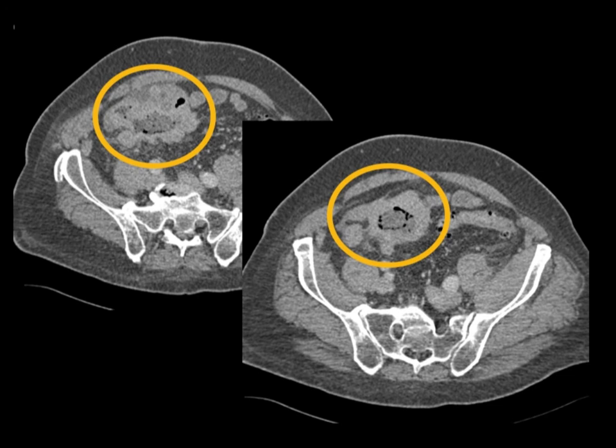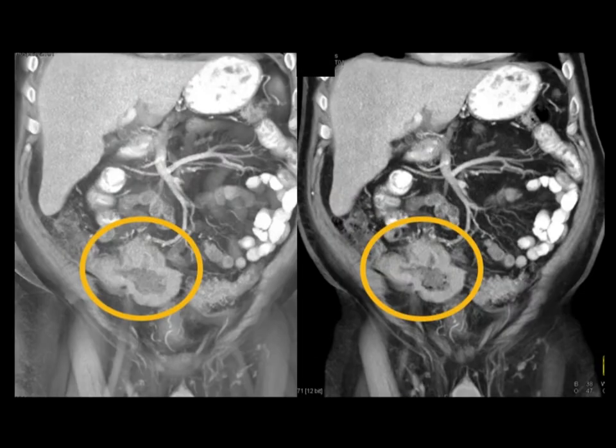And you're really sure it's lymphoma when you scan into the abdomen and you see this large exoenteric mass involving the terminal ileum. A very nice example of lymphoma of the small bowel. You can see here the ulceration on the coronal view. Again, it could be an adenocarcinoma, that's a possibility, but you give the chest with the abdomen, the cardiac involvement, you're talking about a lymphoma.